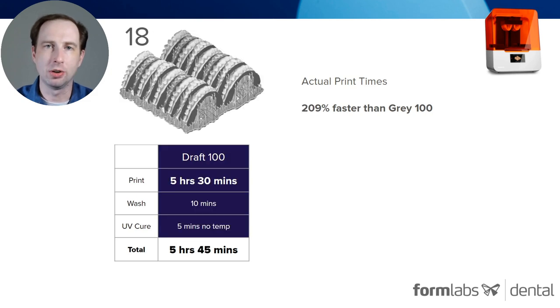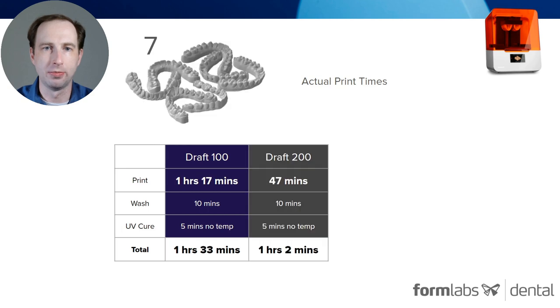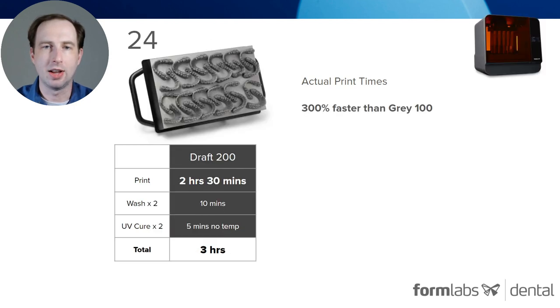Here's an example of 18 vertically placed arches at 100 microns at 5 hours and 45 minutes — 200% faster than Gray 100 on the same job. A 7-model print: Draft 100 printed in an hour and 17, Draft 200 did it in 47 minutes. And here you can see the Form 3BL with 24 models printing in 2 hours and 30 minutes. This is 300% faster than Gray 100.